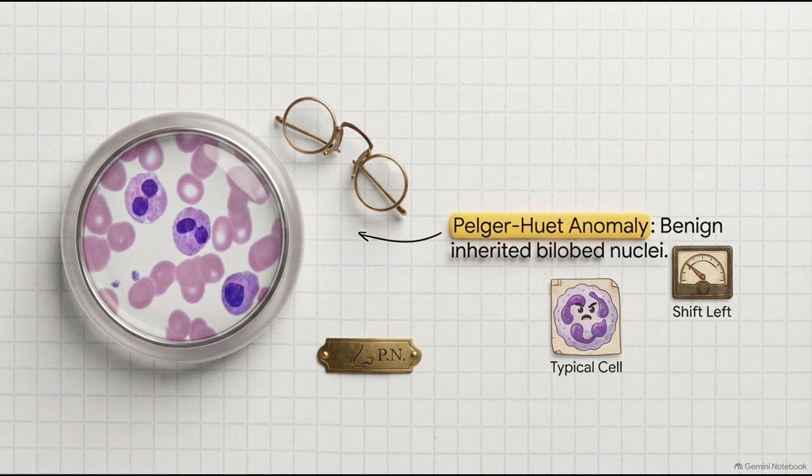Look at those highly distinctive bilobed nuclei. They mimic the shape of old-fashioned eyeglasses. Just remember the mnemonic pince-nez equals pinch nose. This is a completely benign, inherited familial anomaly. But here's the catch. To an untrained eye, it violently mimics a serious left shift.